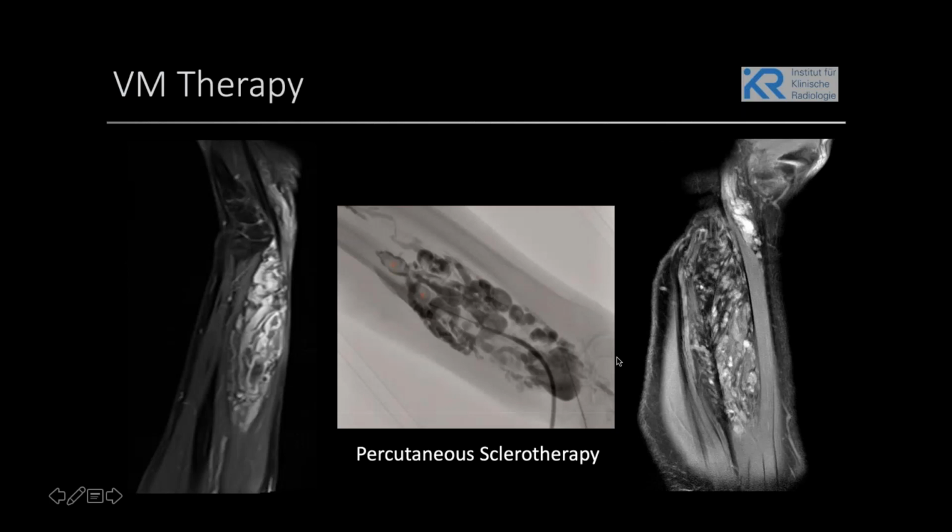These lesions, you go to therapy in interventional radiology by doing a percutaneous needle injection and sclerosing your lesion, with the idea to induce tissue scarring here, so there's no further blood flow to the lesions. But as you see, these lesions can be very diffuse within the tissue, and you will hardly ever get all parts of this. So patient monitoring or therapy monitoring is an aspect which can be improved in these patients.